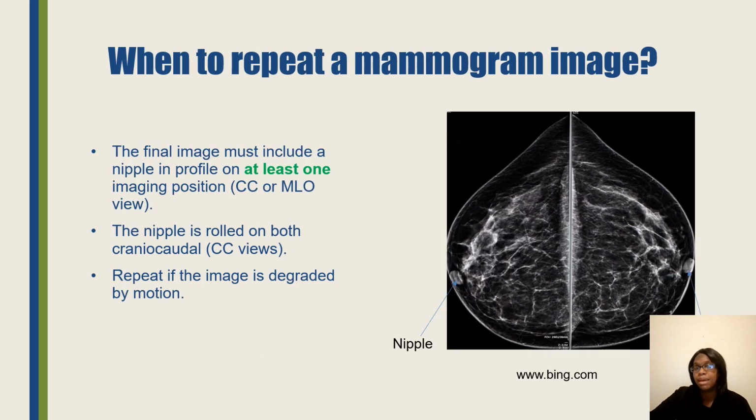When to repeat a mammogram. Your final image should have at least one picture with the nipple in profile, meaning the nipple is pointing outward of the breast. The nipple is not rolled in the breast tissue. If it is, take another picture where you're trying to get the nipple pointing out of the breast.